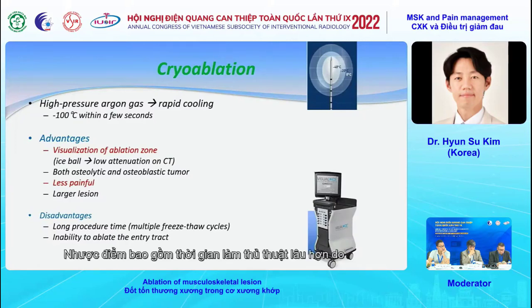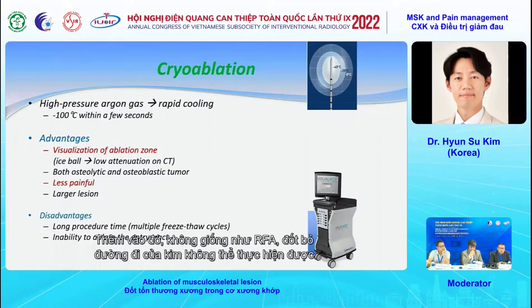Disadvantages include longer procedure time, which is due to multiple cycles of freezing and thawing of the ice ball. Also, unlike RFA, ablation of the needle tract cannot be performed.